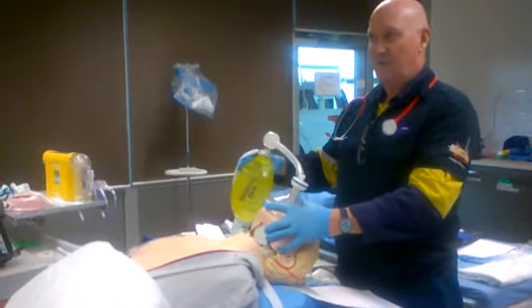Right, we'll then listen with our stethoscope. Someone will be bagging the patient, that's why you need a team member for good placement, but also with capnography. Down in the epigastrium, either side of the lungs, and placement. We have good placement there.